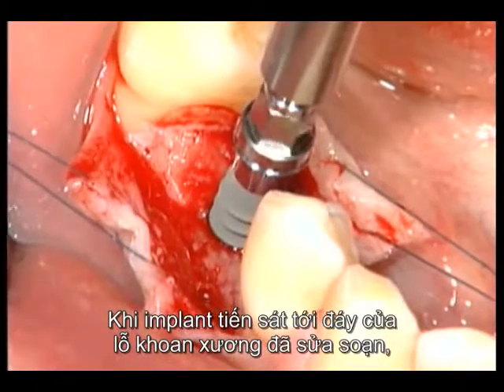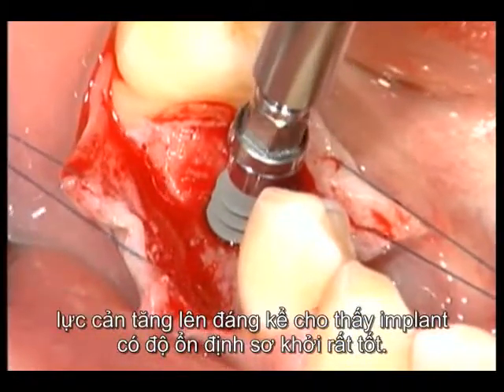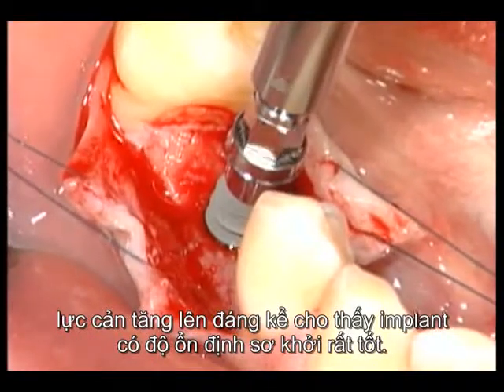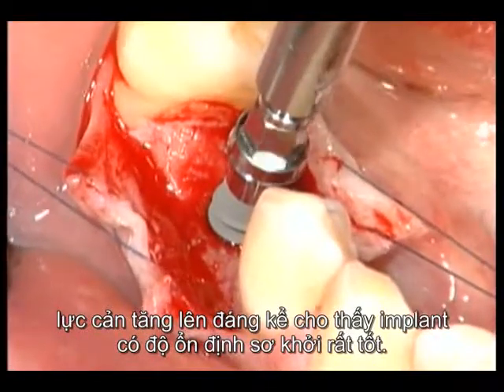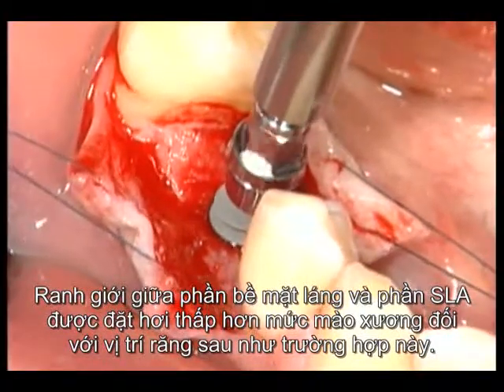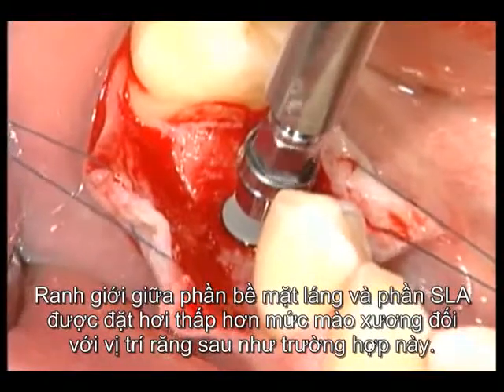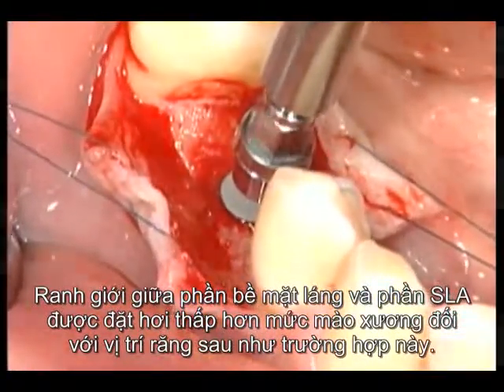When the implant gets close to the bottom of the prepared bone cavity, the resistance clearly increases, providing excellent primary stability for the implant. The interface between the machined and the SLA surface is positioned slightly below the bone crest level in such a posterior implant site.